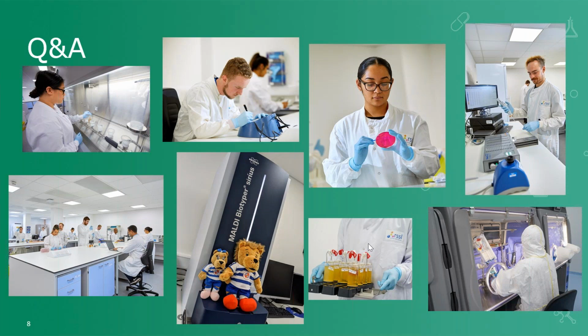So it comes back to the question that Annette asked at the beginning: what contaminates cell cultures? Well, it looks like there's a group of sinister 6 that are the most common. So most Mycoplasma PCR methods would pick those up, but they may not pick up other Mycoplasma.